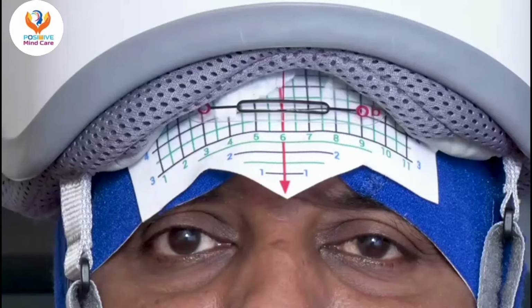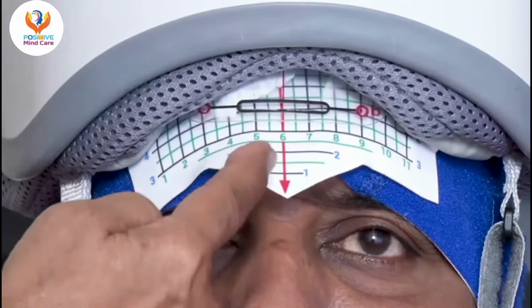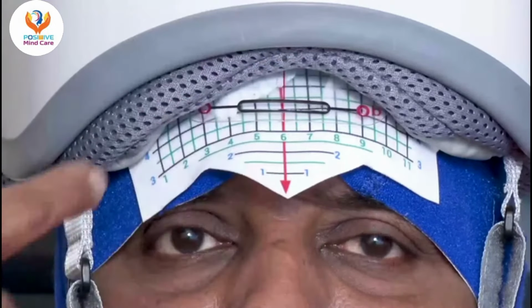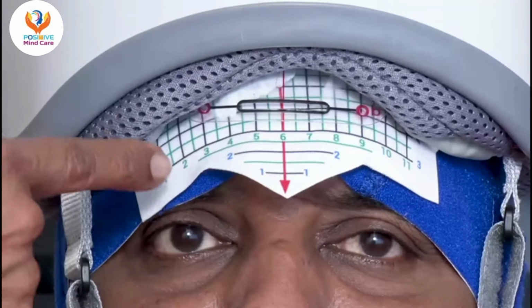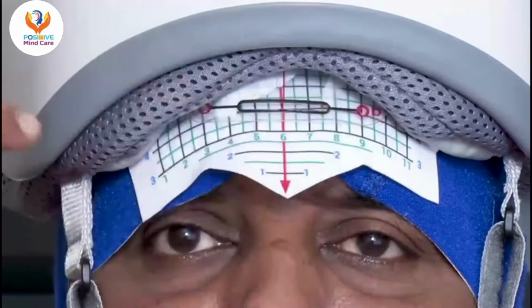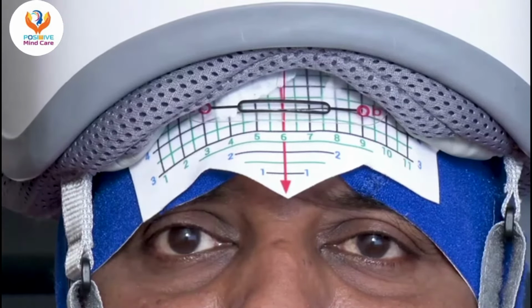From the motor threshold area, we will come 4 points down, 4 lines down. If you observe here closely, now on the grid, you see the 3 points. One is the central red mark, which is in sync with the red mark of the helmet. If you see here, 2 small round red circles. On the right side, it is at the point 3. On the left side, it's at the point 9. And then above, it is at the level 4. That means on the right side, the helmet is positioned at 3-4. On the left side, it is positioned at 9-4.